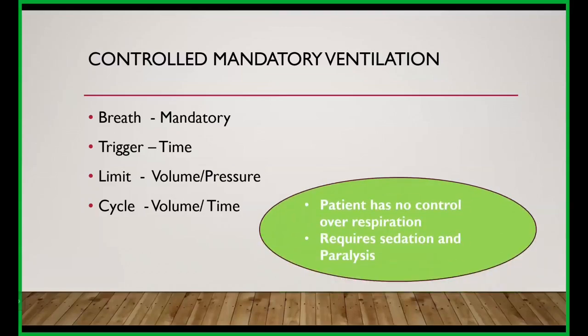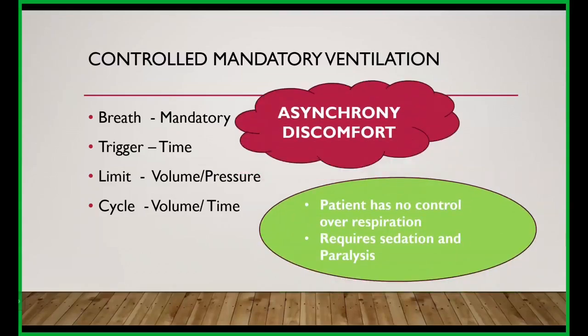So, what is the main disadvantage of this mode? This mode doesn't sense the patient's effort. It is ideal only when the patient is sedated or completely paralyzed, that is, there should not be any effort from the patient side. So the patient requires complete sedation and paralysis, and he should not have any control over respiration. The main complication will be asynchrony and discomfort. It will be like pressurizing a person. So it will give the utmost discomfort due to patient-ventilator asynchrony.